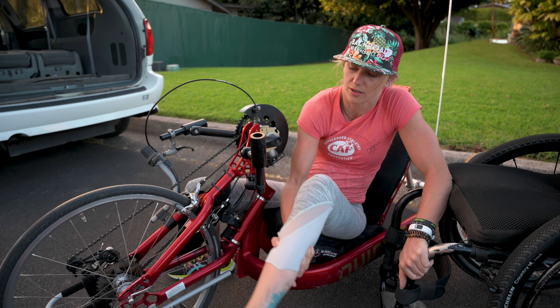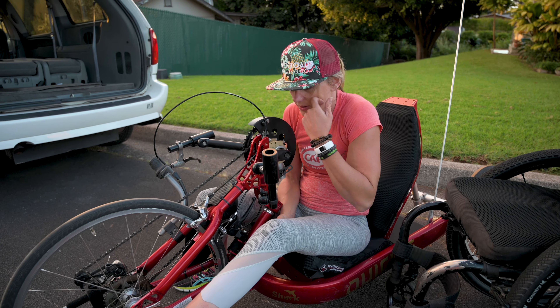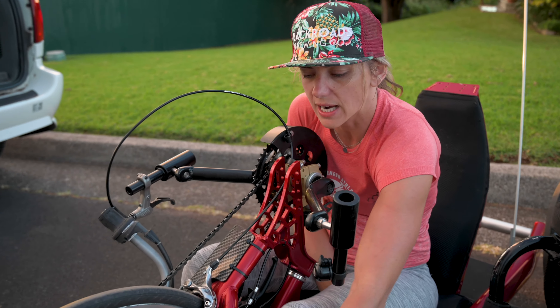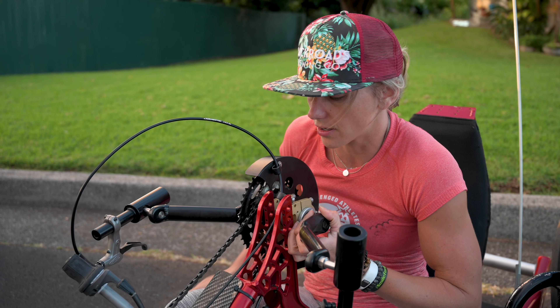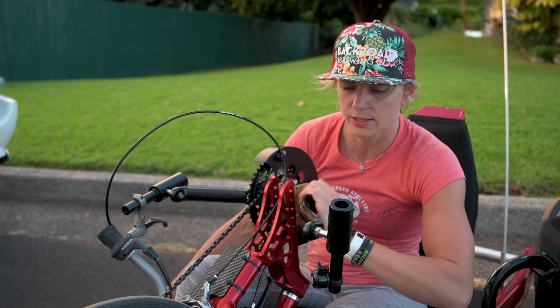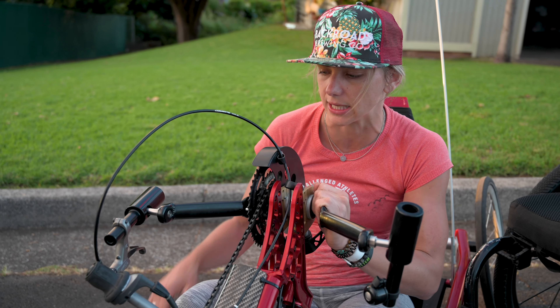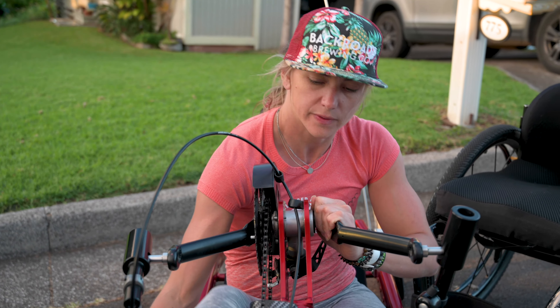Bikes are tough — it's not always easy, especially for somebody that needs a little bit of help transferring. There's a lot of pieces to catch yourself on, so just ask somebody for help if you think it's going to be dangerous doing it on your own. Even if it's just like, 'Hey, can you put your hand here so that I don't snag my skin' — just block some of the pieces that you think might catch you.